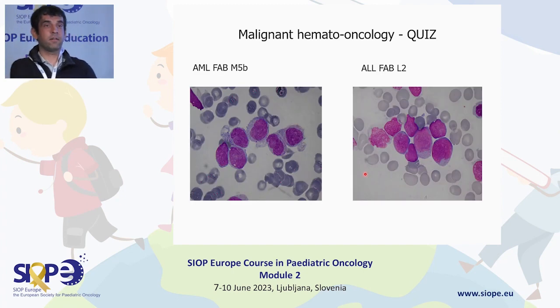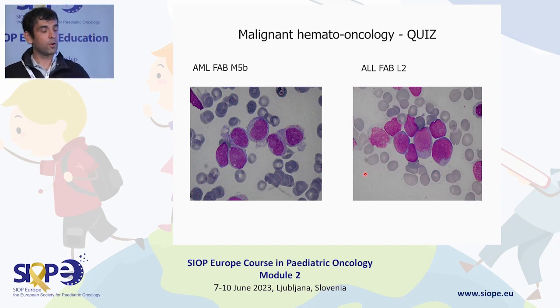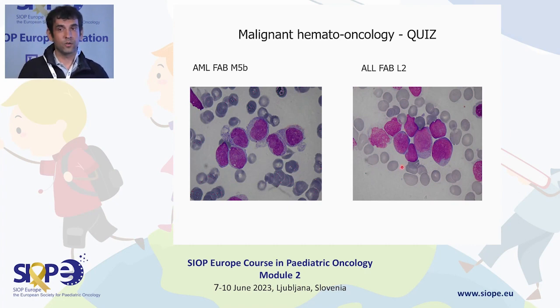Of course, I could not make a photo of the whole bone marrow. But when you go through the bone marrow, you see many of the small lymphoblasts, and then of course you also see the bigger ones. But there is a big number of lymphoblasts which look like the L1 subtype. So there is still a population of small classic lymphoblasts. And I would treat this patient, of course, with corticosteroids and not think about an AML case.